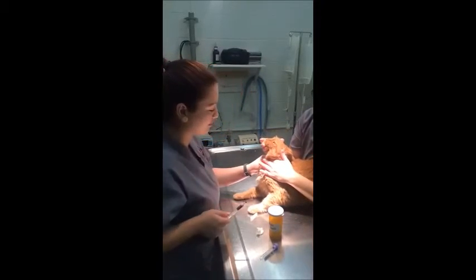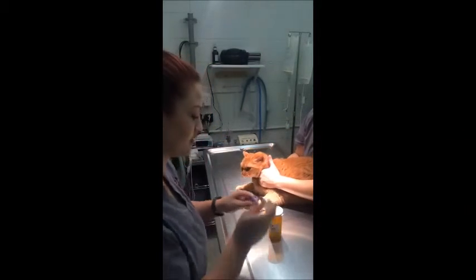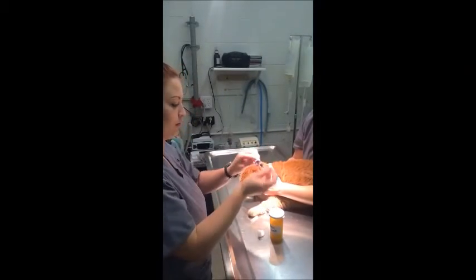Okay, I'm going to release pressure. I'm going to have my holder hold off for 60 seconds, and I'm going to place this into the tube and just slowly rock it.